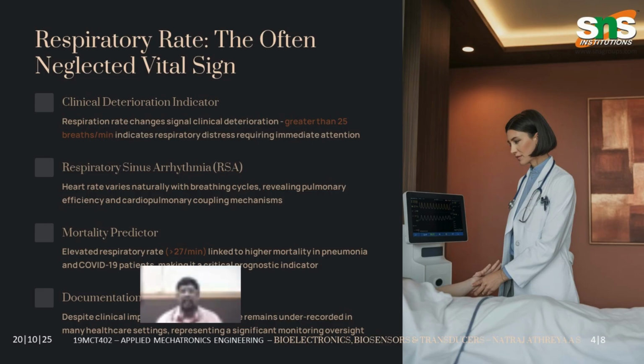Then we have advanced respiratory measurement systems, like wearables now, right? From spirometry to wearables. First is the direct measurement method, spirometry. What it does is measure respiratory gases during exercise.